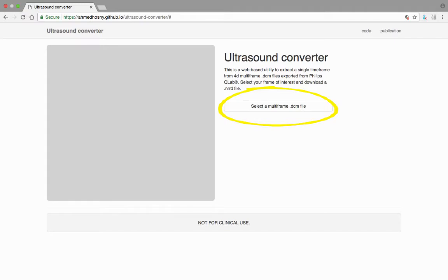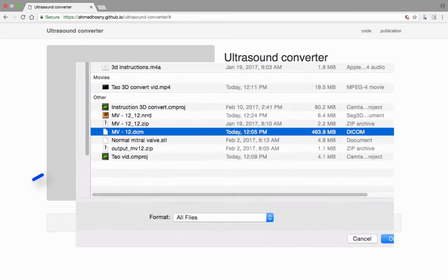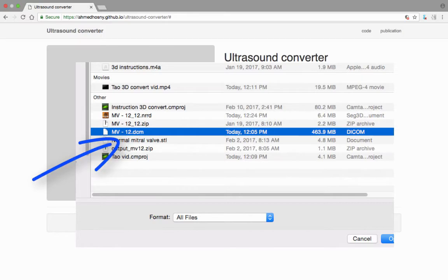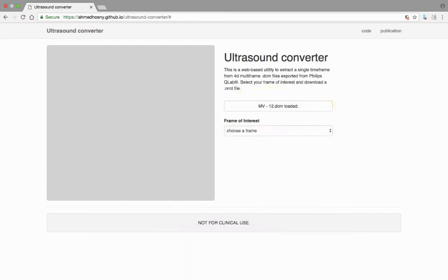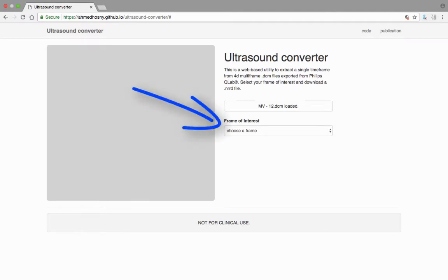Click on this link to load the DICOM file from its storage location on your computer. After clicking the link and selecting the file, the loading process occurs automatically. Once loaded, a second drop-down menu appears on the site below the Select a Multi-Frame DICOM File link.